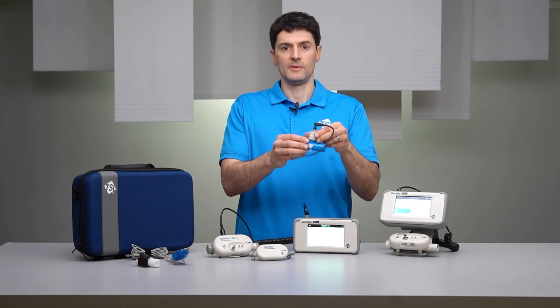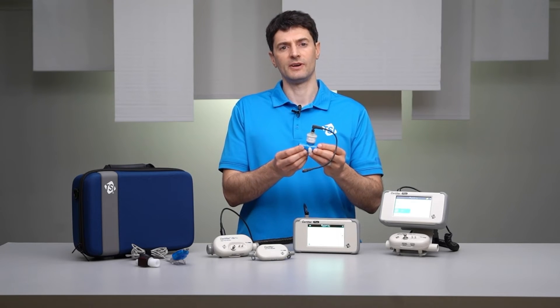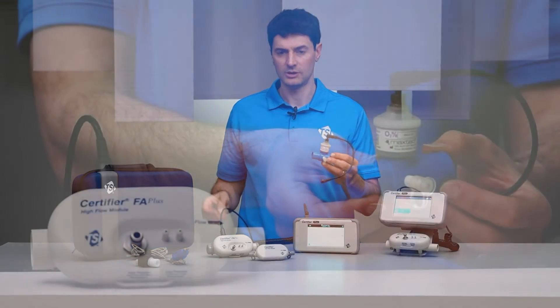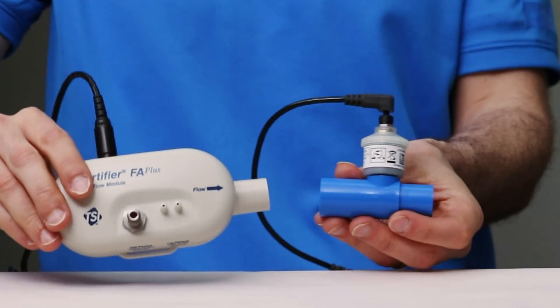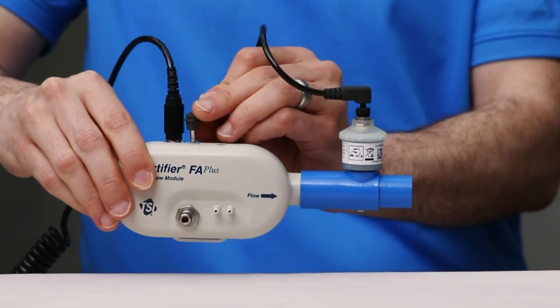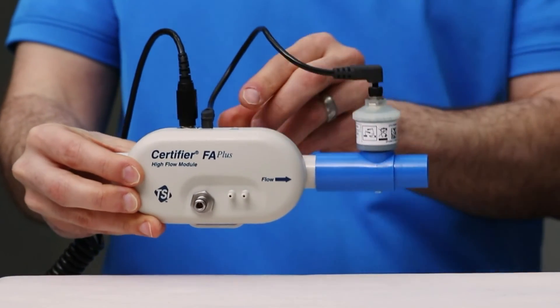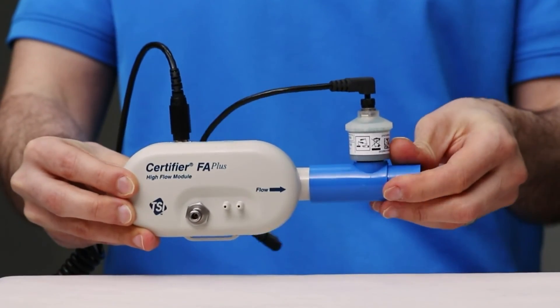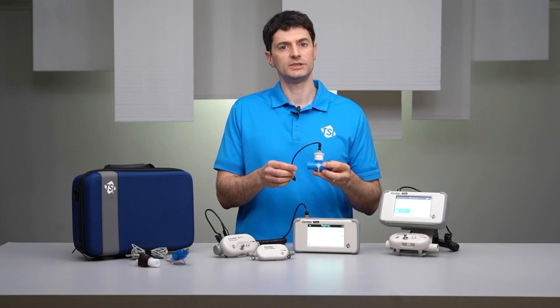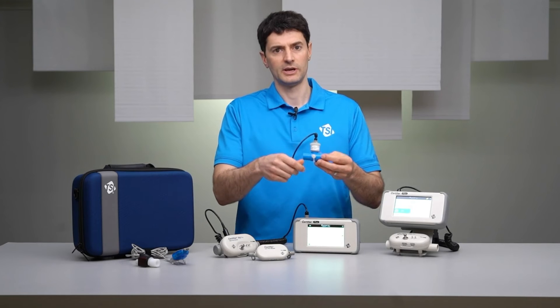The oxygen sensor measures the real-time oxygen concentration of gas flows and is used to test ventilators, gas blenders, and other devices with oxygen flows. The O2 sensor is connected to the test circuit and then plugged into the high flow module, and the readings are displayed on the interface. The oxygen sensor is an accessory for the Certifier Plus and is sold as the Model 4073 oxygen sensor kit, which includes the O2 cell, the adapter, and the cable.